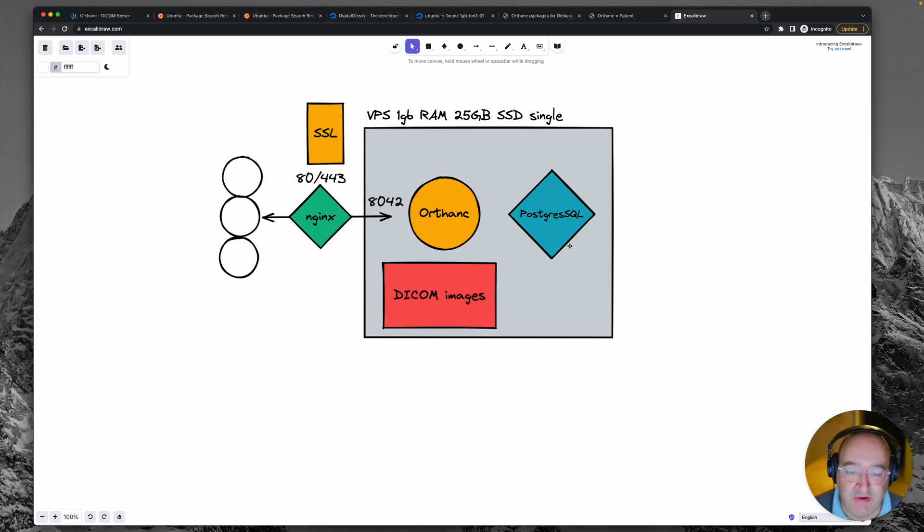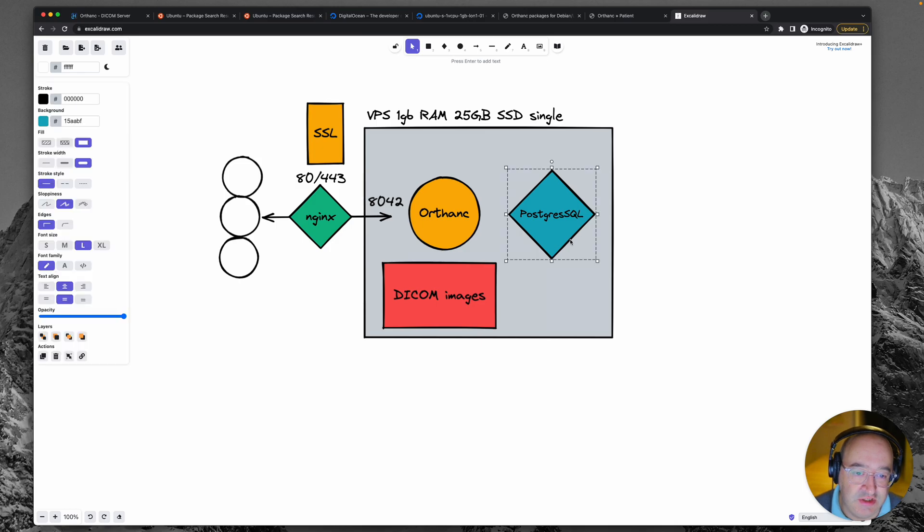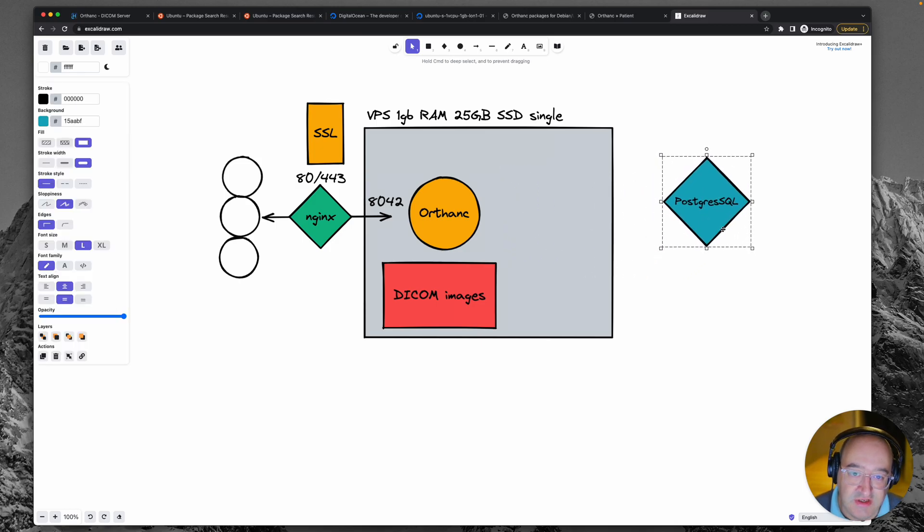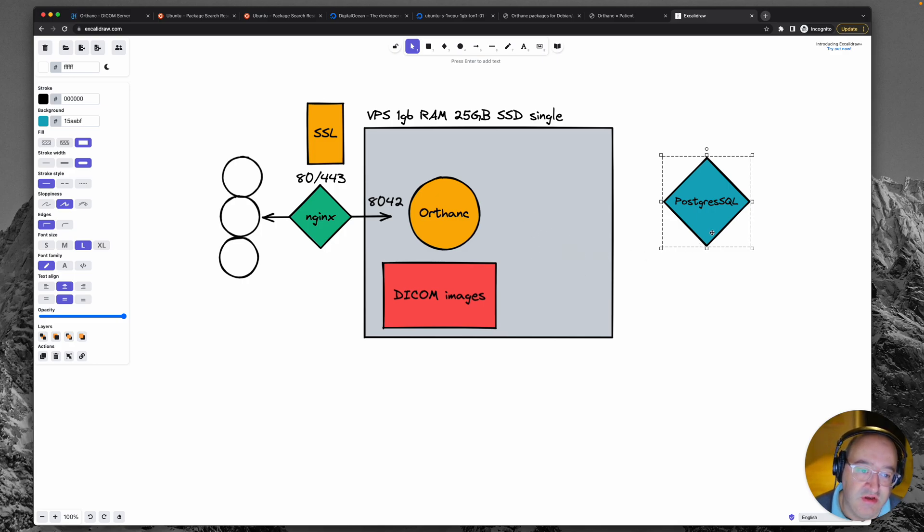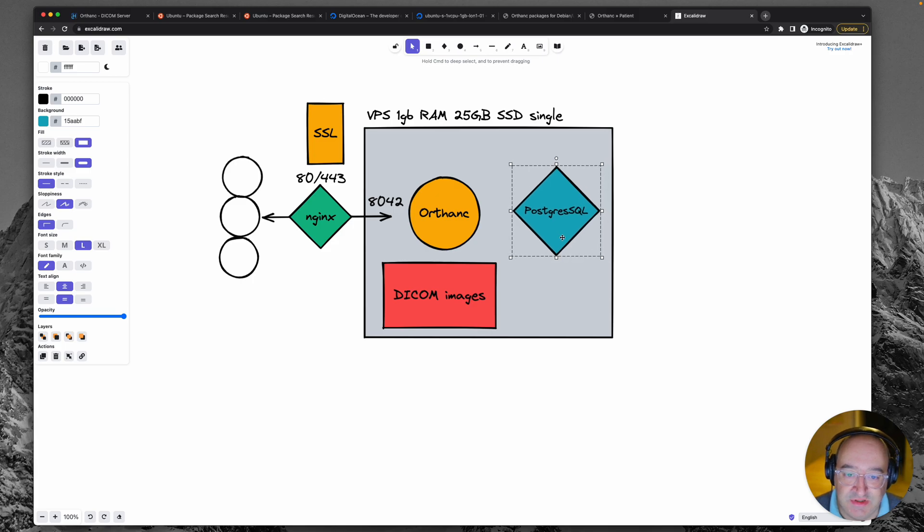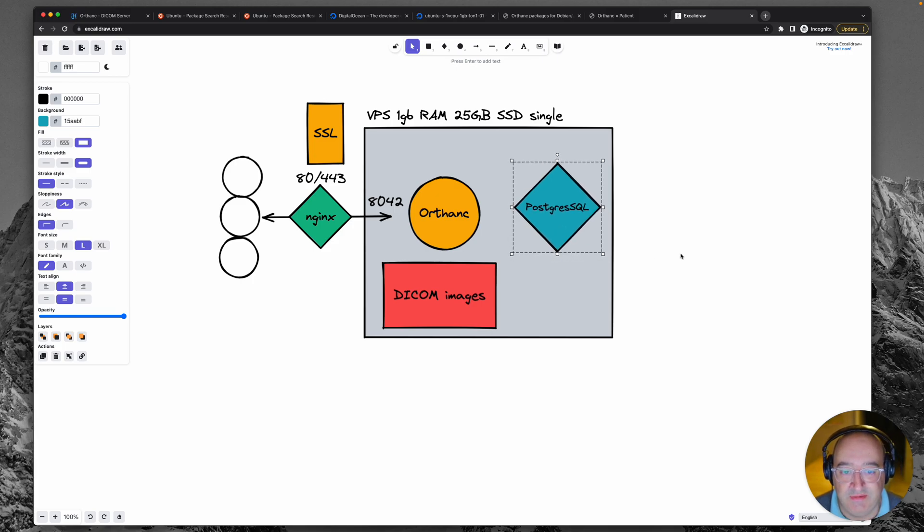So we'll swap out with that. Now what you could do is you could move that to a different server so that it offloads the computing power of this server. But actually for now I'm just going to leave it on the same one.